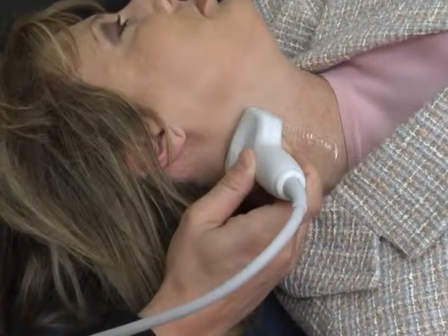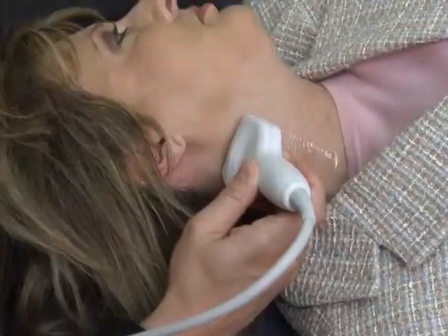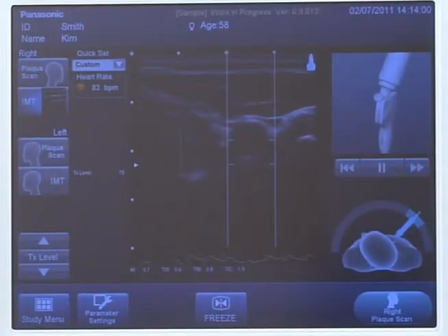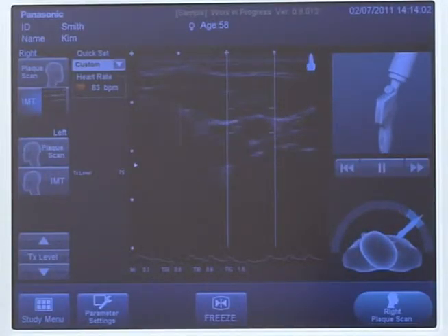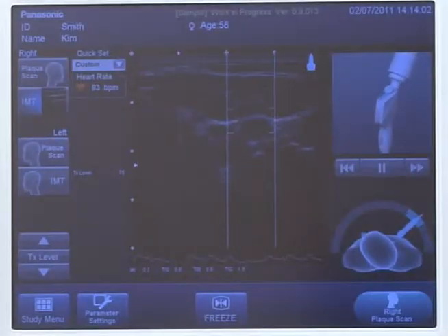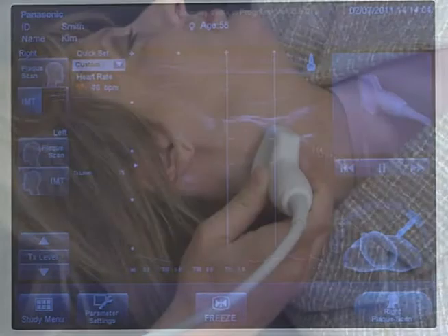Continue to scan up the neck in a transverse manner until you see the vessel becomes wide. This is the carotid bulb. Continue scanning to see the internal and external carotid arteries.